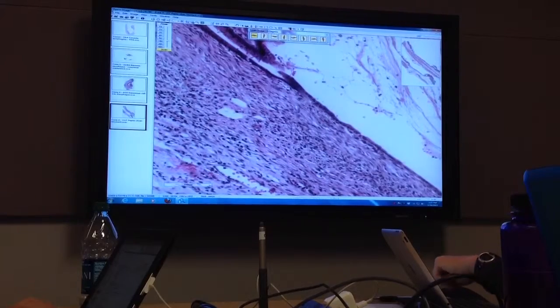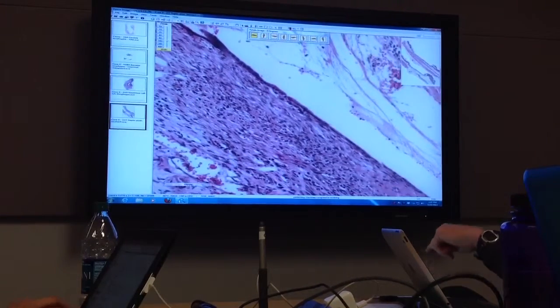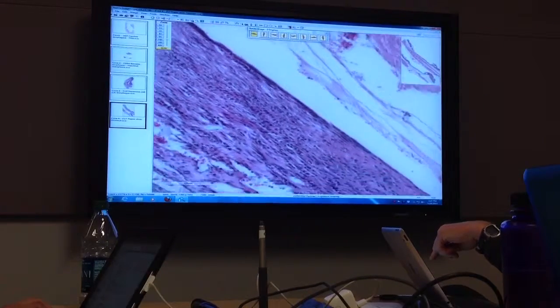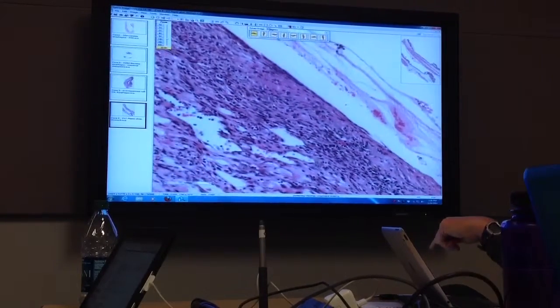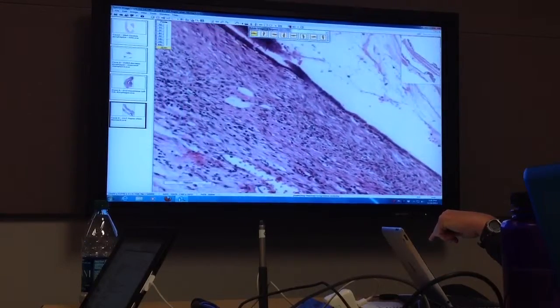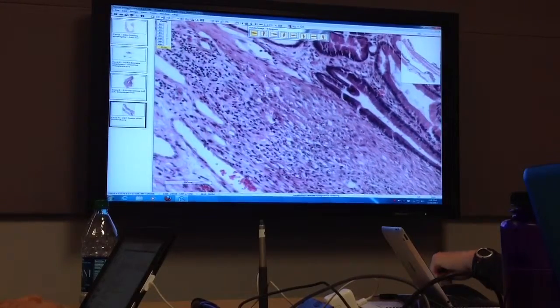And then look at this epithelium. Here's some epithelium. It's a little skinny single layer trying to crawl across here, right? And these cells look very reactive. It's trying to heal. It's trying to cover itself. And it's just not quite there. But this is what happens. It'll heal and then it'll start regenerating again. Okay? And you'll always have a little scar where the ulcer was.